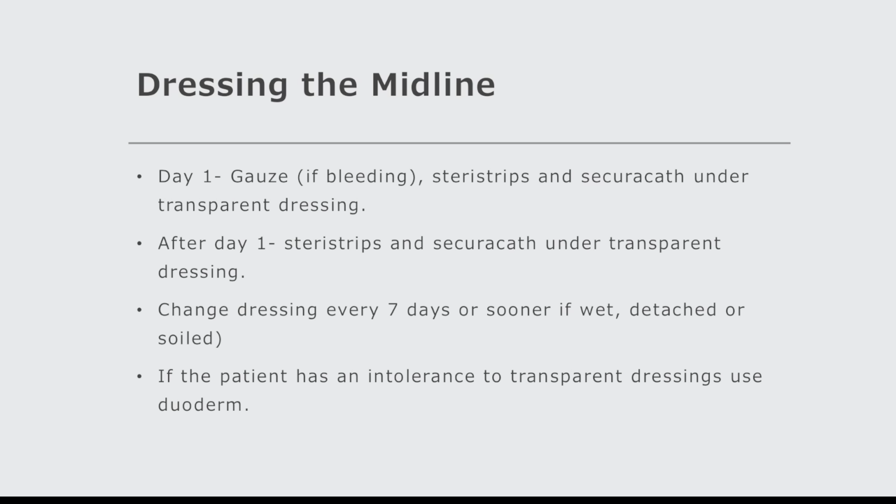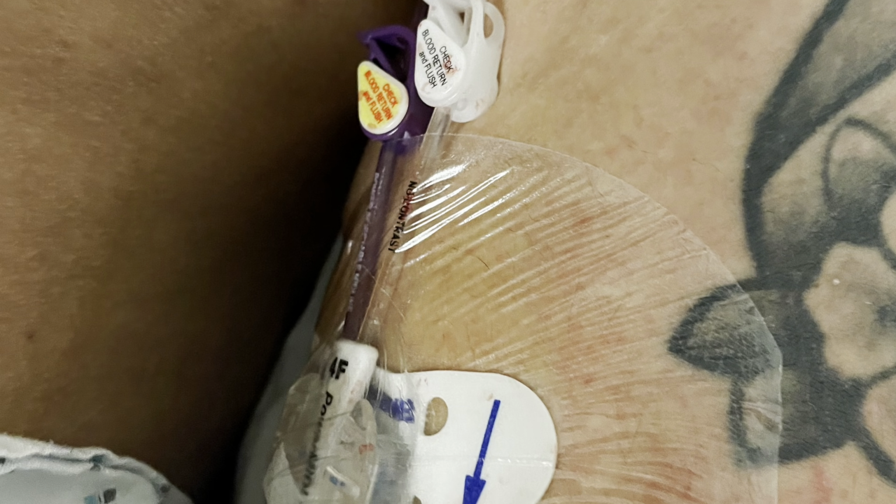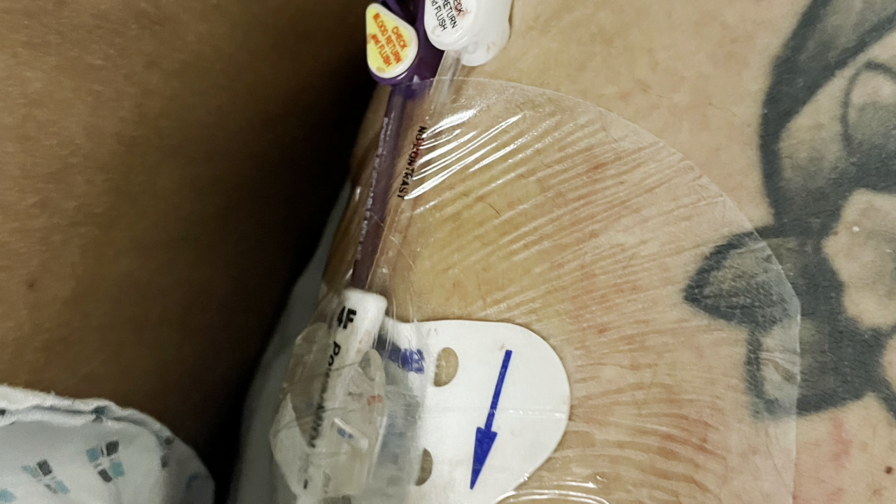The device is secured with steri-strips and a Securicath under a transparent dressing. Change the dressing every 7 days or sooner if wet, detached or soiled. If the patient has an intolerance to the transparent dressings, use Duoderm.